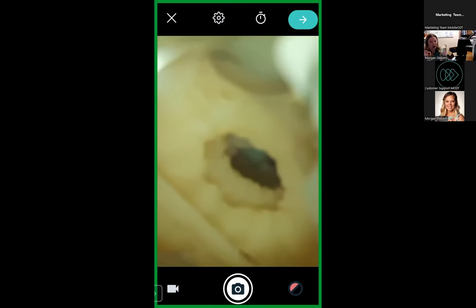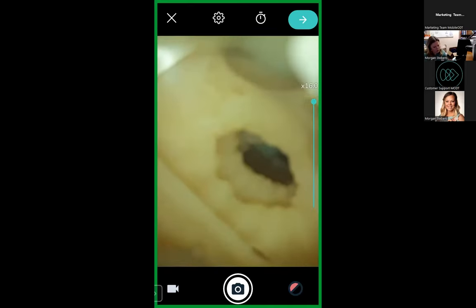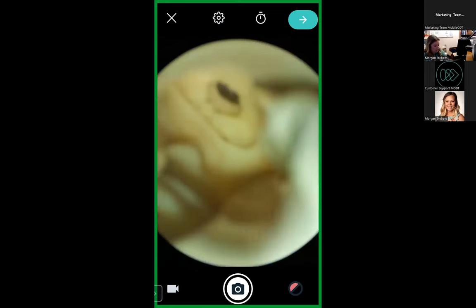So you can zoom as much as you want. So say there was an injury, there's not really a cervix in this because this model is not a medical grade mannequin with a cervix. But if I wanted to, like that's kind of blurry, right? So I'm going to back out just a smidge and I'm going to touch it and see if it'll readjust. But if you really wanted to get close, you could get close. I want to zoom in on an injury, you can zoom in on an injury and really take your time in photographing within a vaginal vault or getting pictures of the vaginal walls or the lining. I can move this whole stand closer and adjust to get any kind of photo I want.